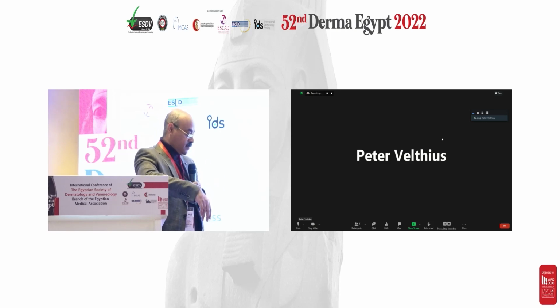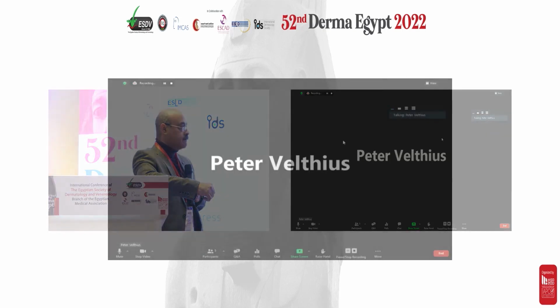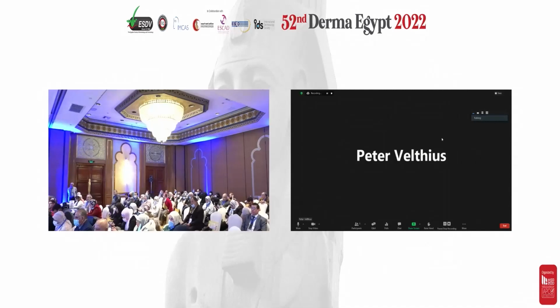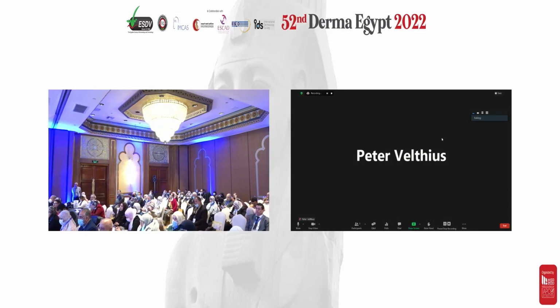When do you use laser? Is this question for me? Yes, for you. Well, with other modalities, such as creams, the lesions of melasma also tend to recur, and people sometimes overtreat and get other problems from the hydroquinone, for instance. We also use the triple therapy, as Albert does, but we see some side effects from that. Now we have this Pico laser, which has such a short pulse length that no heat is delivered. It's just an explosion of the pigmented particles, and we think we're quite safe with that. So that's why I'm using it, as a sort of rotation therapy with the other modalities.